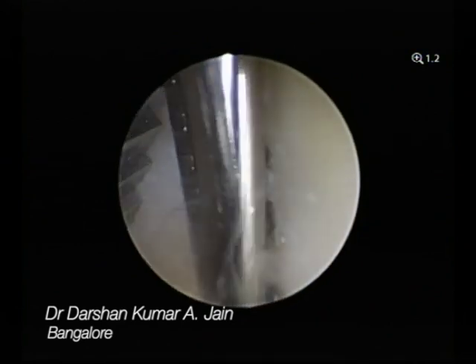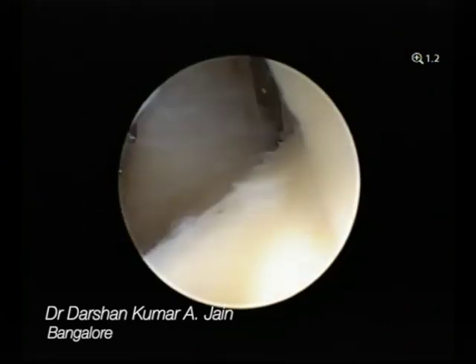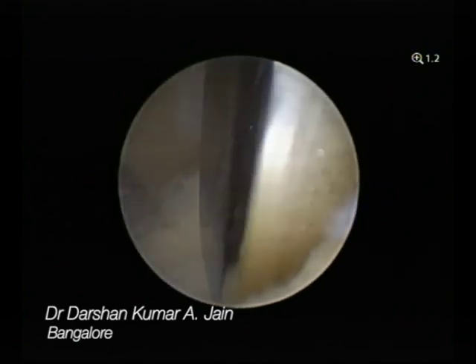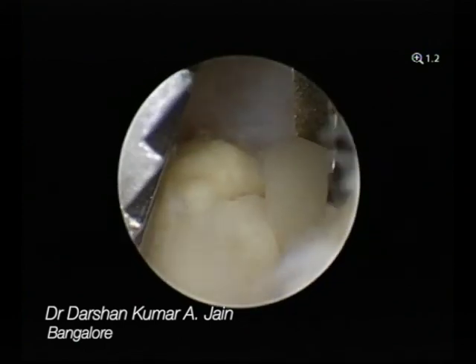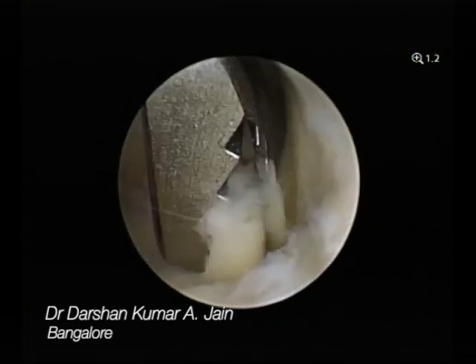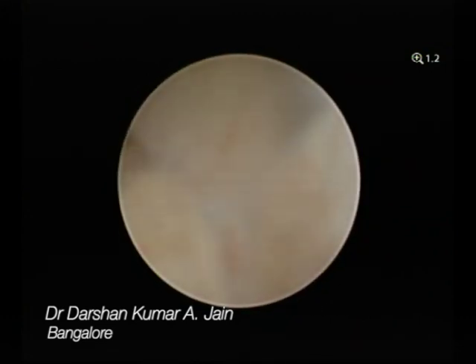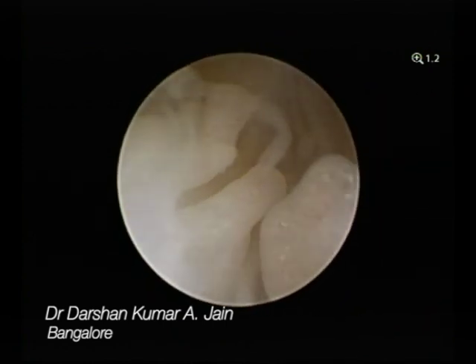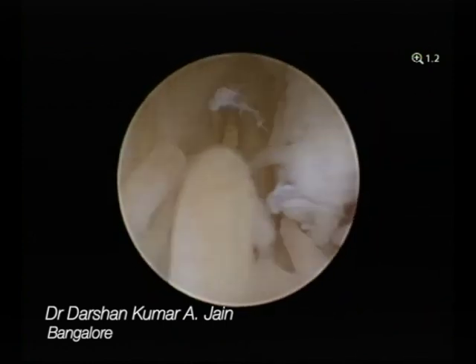You clear off the fluid and synovium. You can see there are small erosions of the cartilage, and simultaneously you take a sample of the synovial tissue for biopsy, which is essential to prove our diagnosis and determine the cause of the problem. This essentially serves both a therapeutic and a diagnostic purpose.